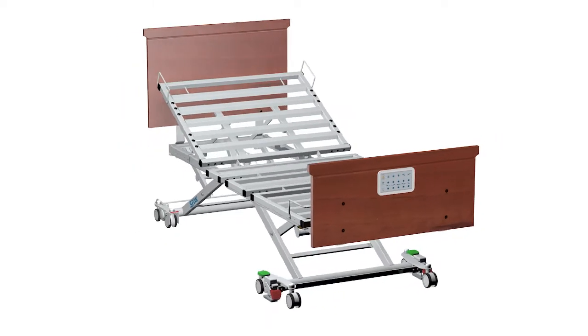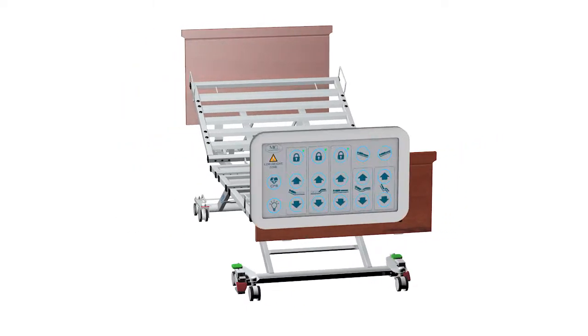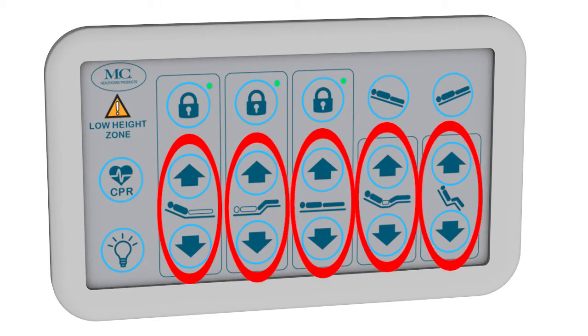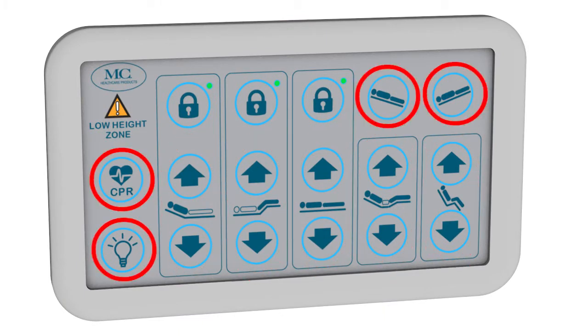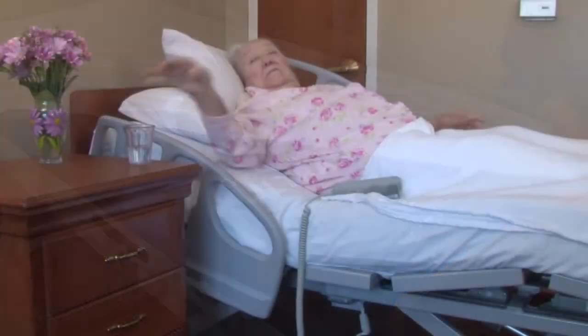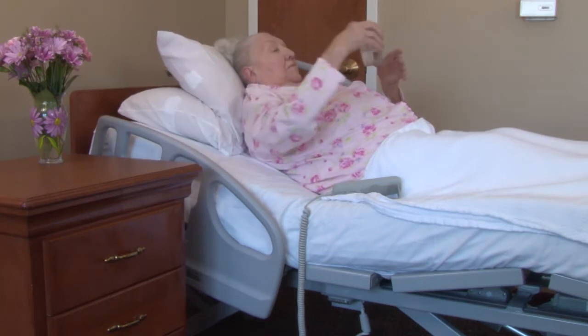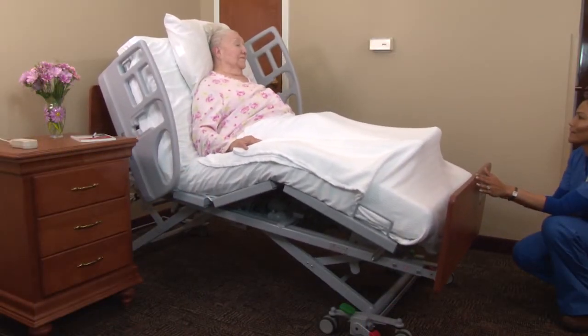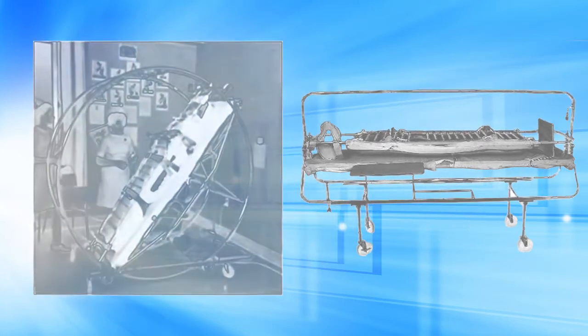Positioning features allow the patient and caregiver the flexibility to conform the bed for a ventilator dependency, feeding tubes, pressure injury prevention and treatment, combined with a therapeutic mattress, activities of daily living, or ADLs, and safe handling of the immobile and/or obese patient. Special positioning bed frames, like the Stryker frame and Circle electric bed, have been around for many years to treat specific patient injuries.